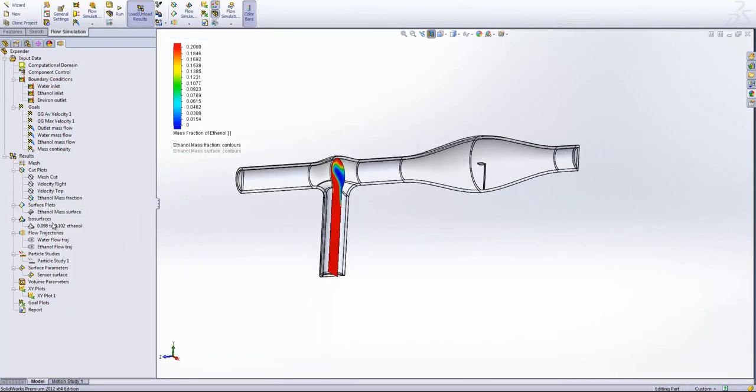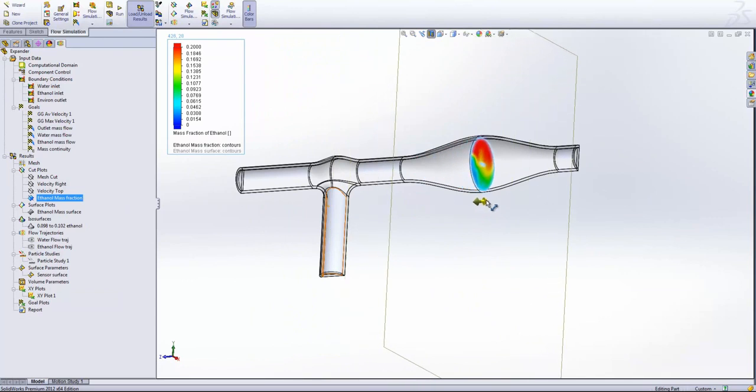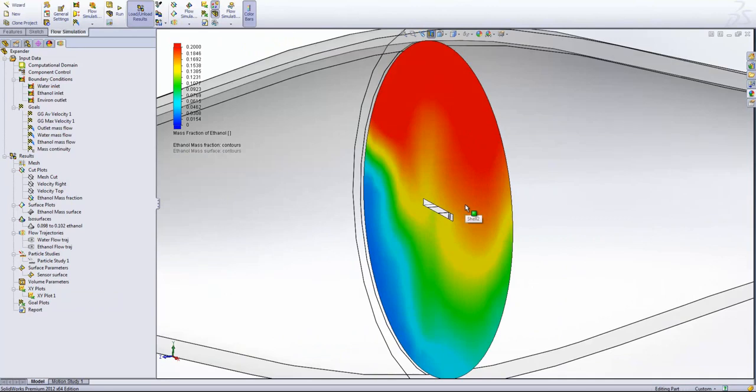So the most important thing we're going to have a look at is the mass fraction. I've got another cut plot of the cross section here, and we're just going to use these arrows again and drag this through. We can see that upstream the structure is still very separated as we had before, and as we bring that cross section through, we'll see that while I have reduced the flow speed in that area, we haven't actually improved the mixing capabilities of the pipe. In actual fact, this cross-section looks to be worse than it did in the previous design. We've got the sensor sat in a pretty strong yellow band now, which means that we've got a higher concentration of ethanol in this region than we are looking for on the sensor. Again, we should be looking for that value to read 0.1, and hence we want the sensor to be in a nice green region.